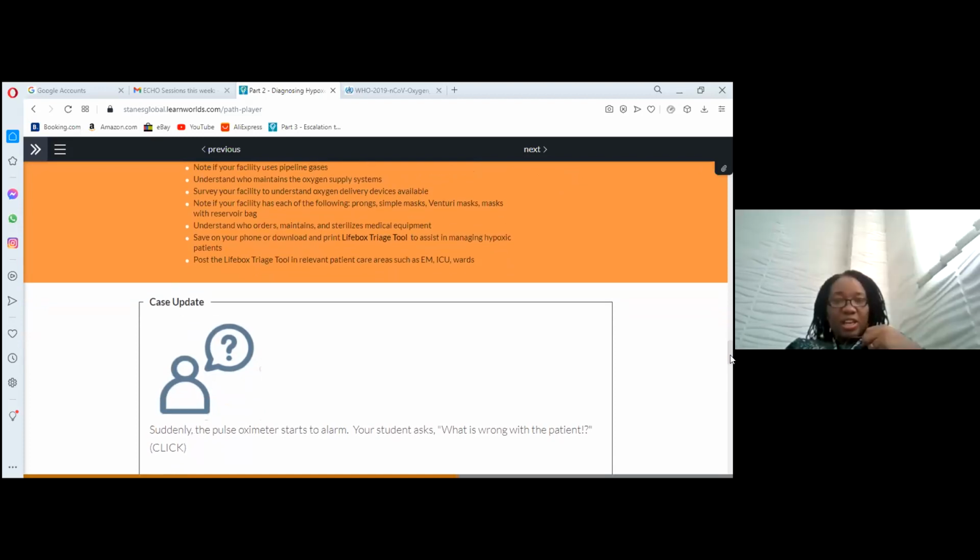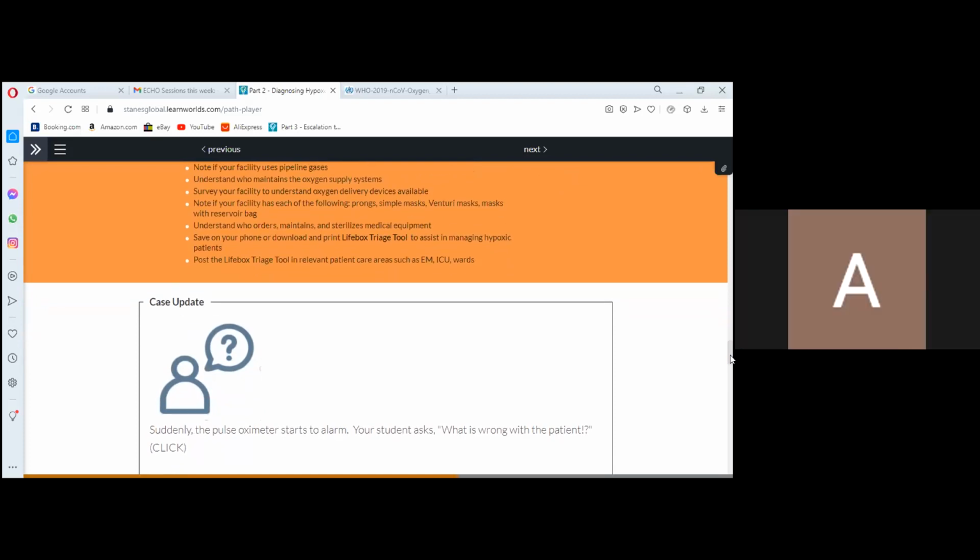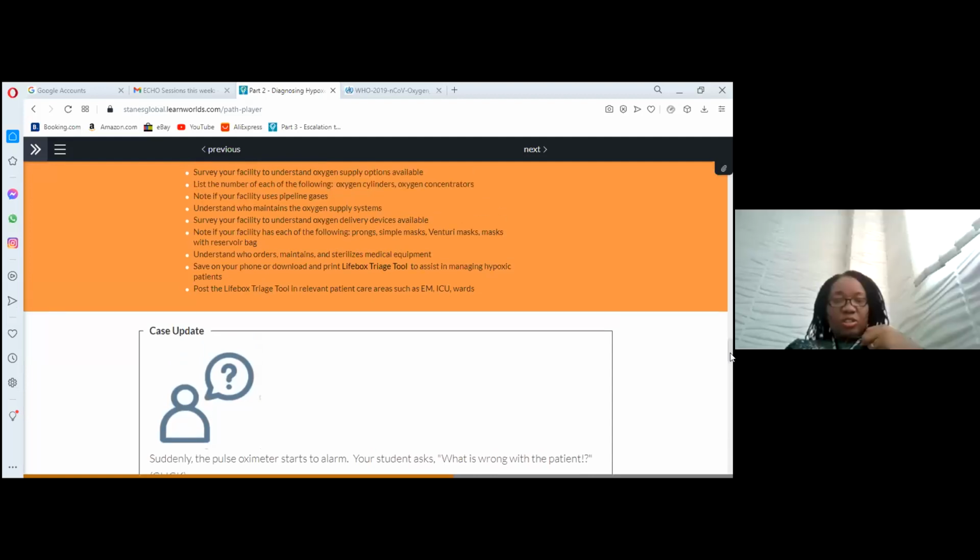Sorry, Dr. Datti, please, can I just add one thing based on the change of practice? I think it's done in some centers, so it's something we can learn: at the beginning of your shift, it's nice to find out from the head of the oxygen plant what the status of oxygen in the hospital is. What number of patients do you have either in the ICU or the A&E that require oxygen? Then I found the use of oxygen concentrators very handy because we're taking from atmospheric air. Now we are worried because we don't want them working continuously because of the motor function.